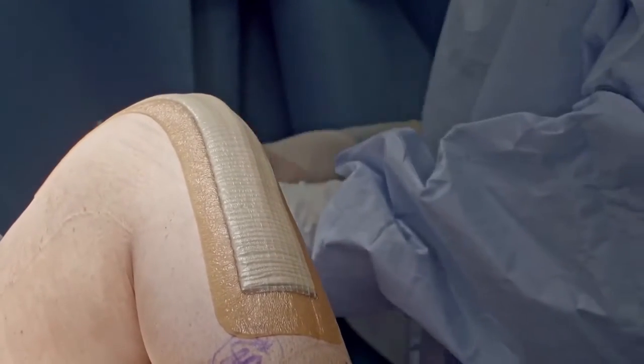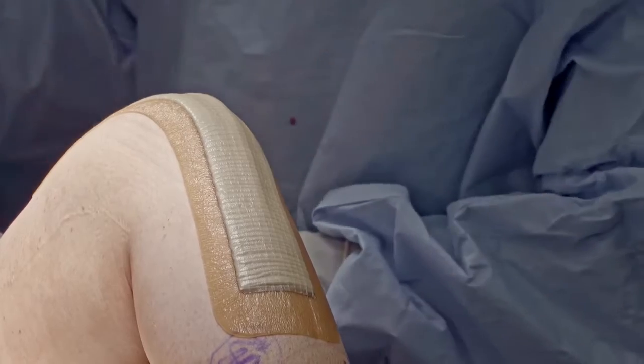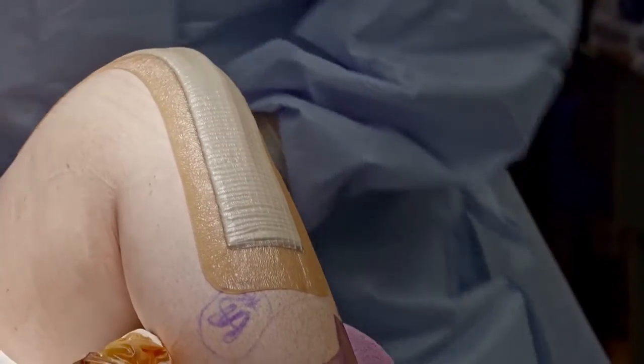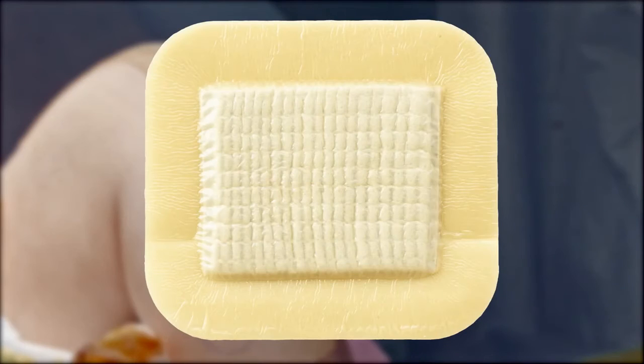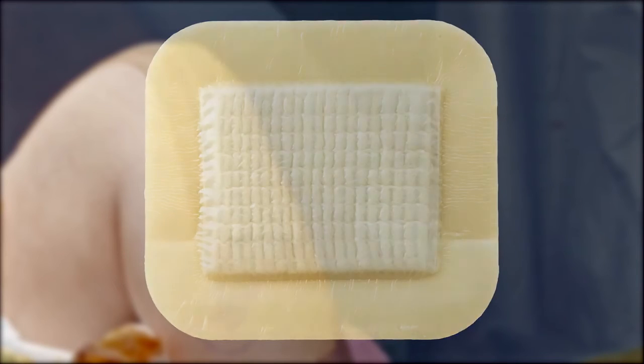If you choose to use drains, they should ideally be placed away from the area so that it does not affect the seal of the adhesive border. If you are doing robotic surgery or navigation, you may use the 4-inch AQUACEL Ag surgical dressing, as this protects the pin sites from potential surgical site infection.